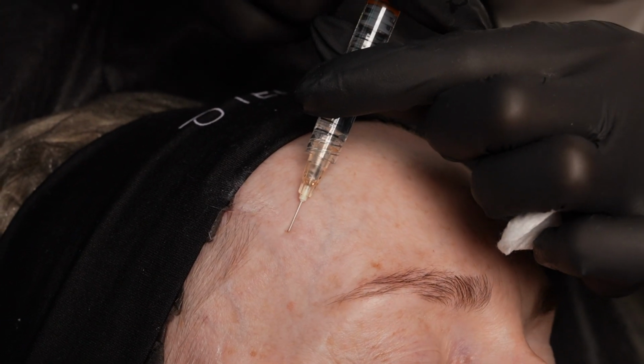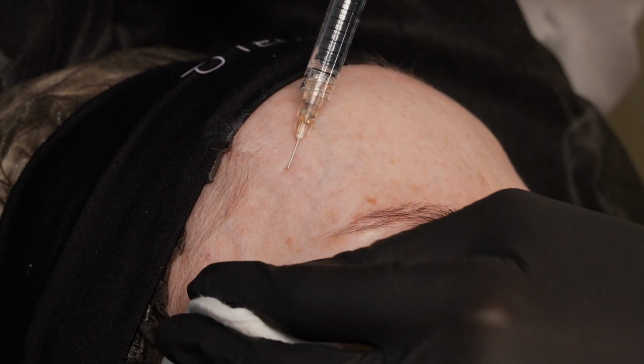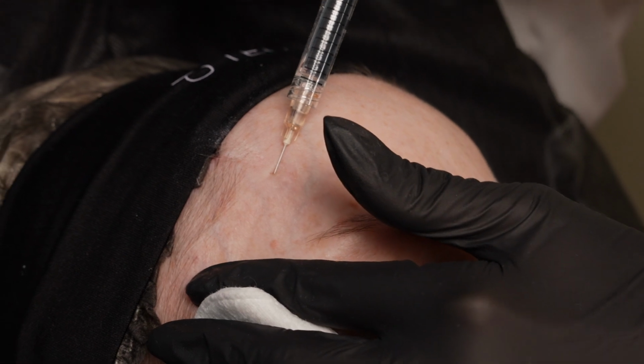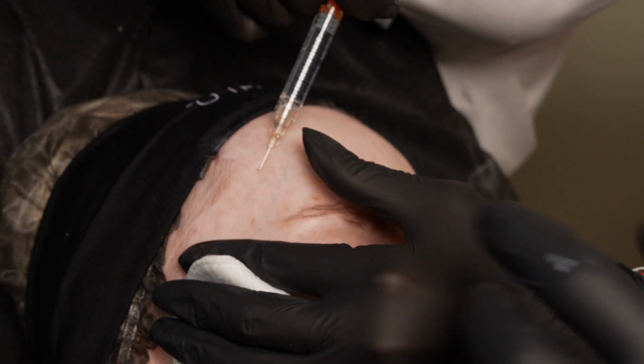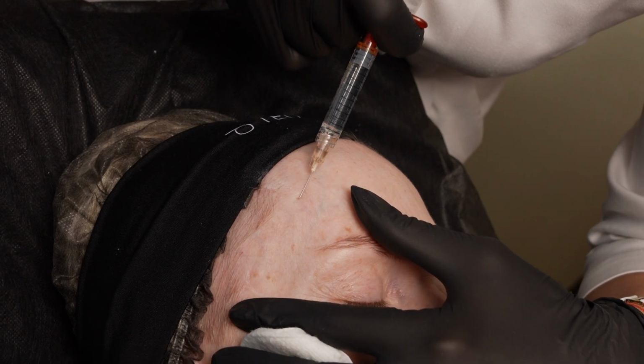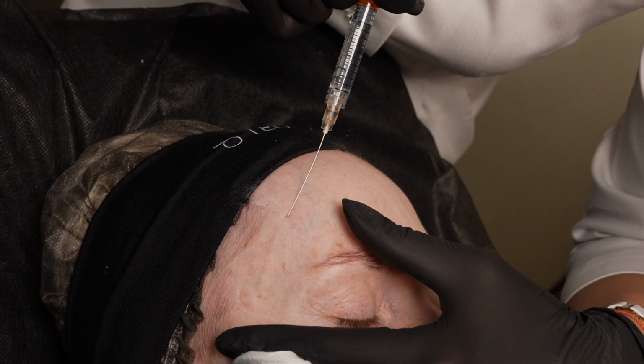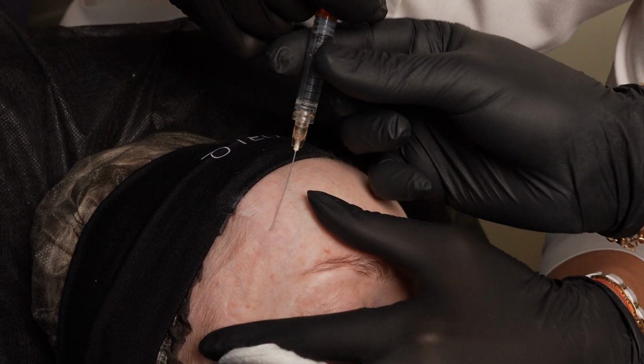Mark it. Down, down, because all the danger is up, so give it down. Just a small amount. You should press. Did you inject? Yes. Okay, good.